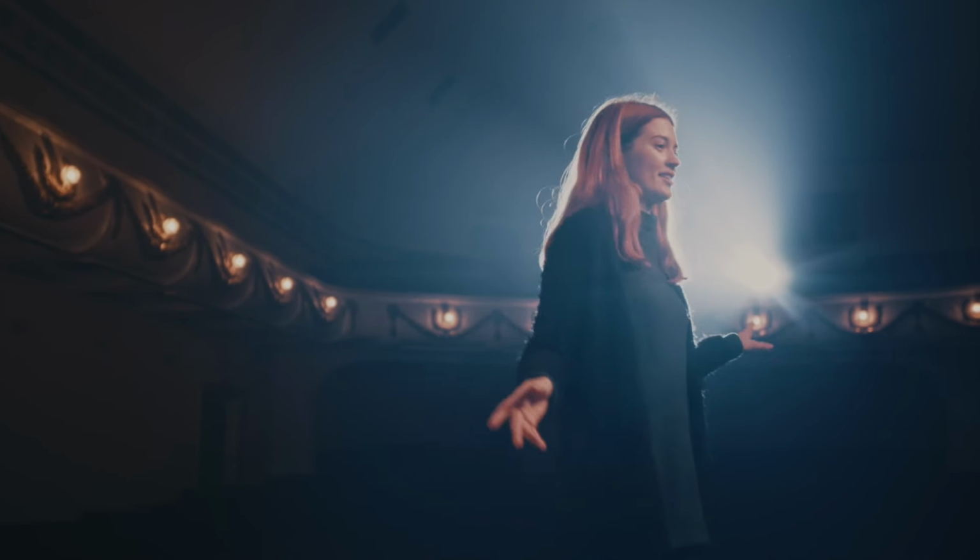That's the beauty about Invisalign, is that if you do have a big speech coming up or you have something coming up that's important, you can just slip them out, give your speech without the aligners, and then slip them back in. But if your whole job is on the phone all day long, in order for you to get the results that you're looking for, find a way to learn how to speak with these in there. That just takes practice.